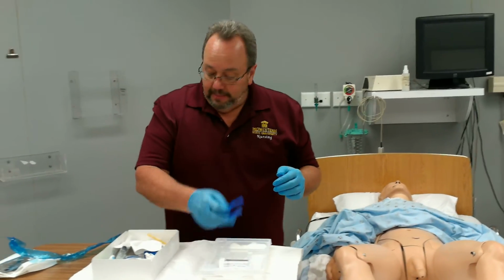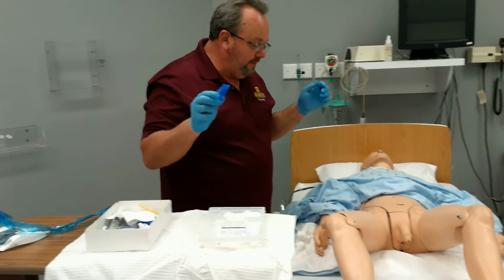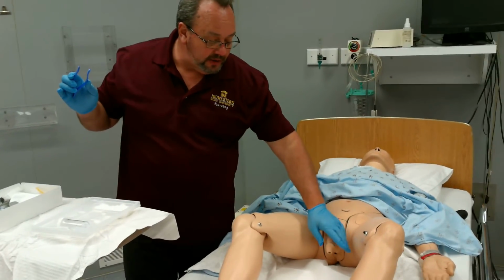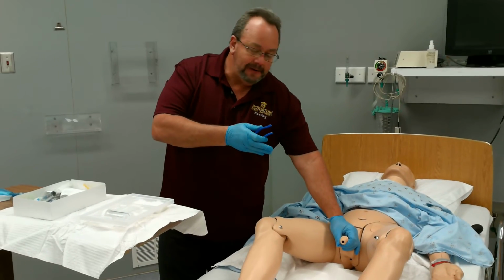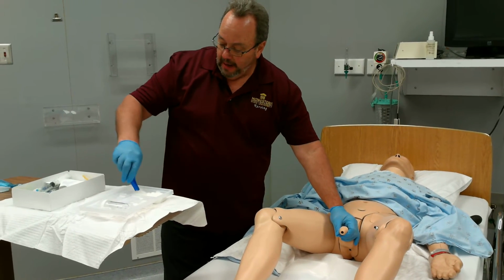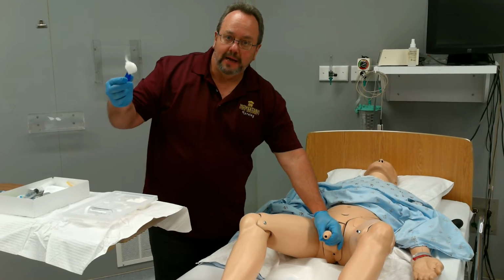Then I'm going to take my tweezers, my pickups here, and I'm going to tell them, I'm going to touch now. And this is where I will touch my patient. I will grab hold, and once I've touched with that hand, I will never let go of that. This hand will never go back into my sterile field. I will take the first cotton ball. This has been soaked with betadine.